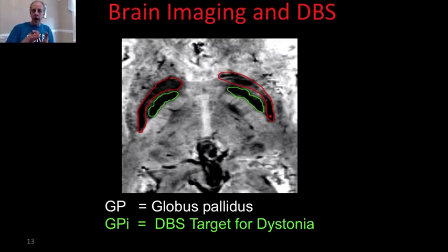And the beauty of that is that when we talk about active contours, normally we talk about gradients of one image. Now you can take gradients of multiple images because you have multiple modalities together. So we talk about T1, T2, the susceptibility weighted image. You can actually compute gradients with all of them together. Remember, we talked about vectorial gradients. So now at every voxel, I don't have one scalar number.